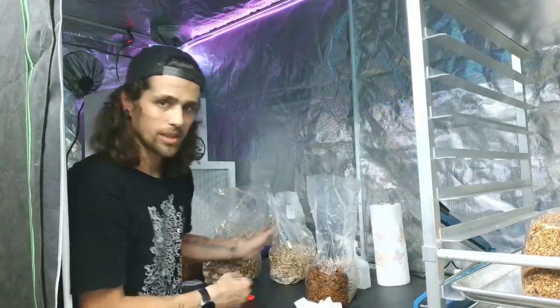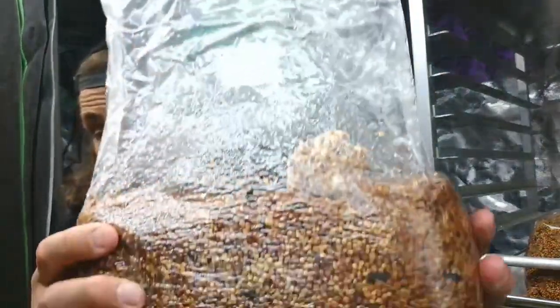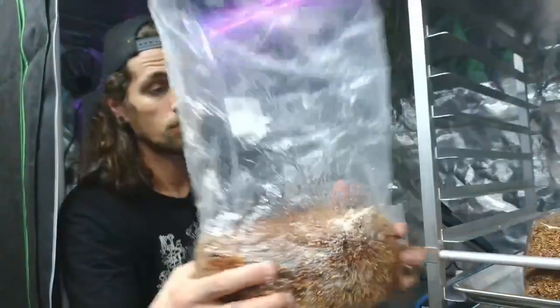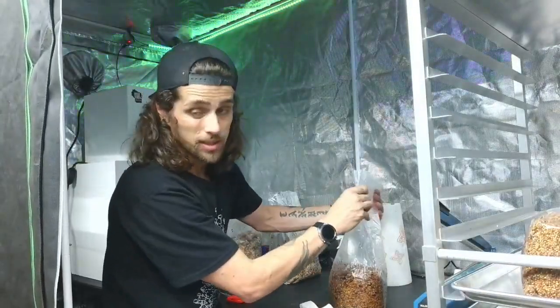Literally just that little bit — you don't even have to have that much. I don't know how well you can see it, but I'll get the bag sealed, then break it up further and mix it up really good.